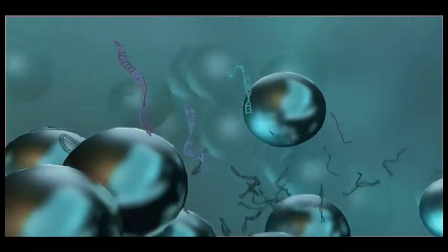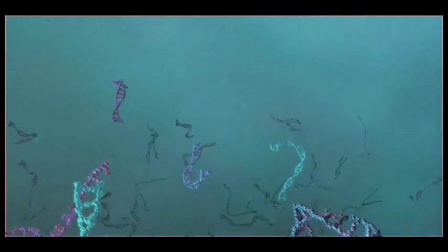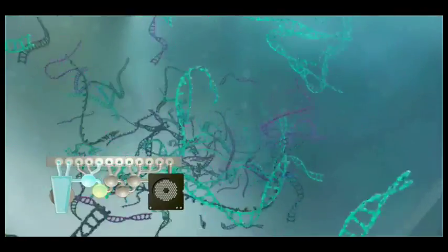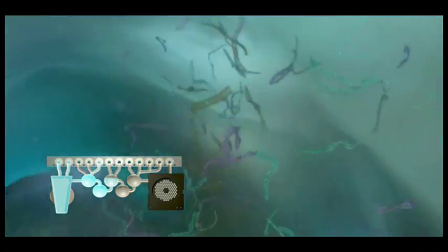Next, an elution buffer releases the purified nucleic acids from the magnetic beads. The magnetic beads are again magnetically secured while the nucleic acids are moved to the first stage PCR chamber.